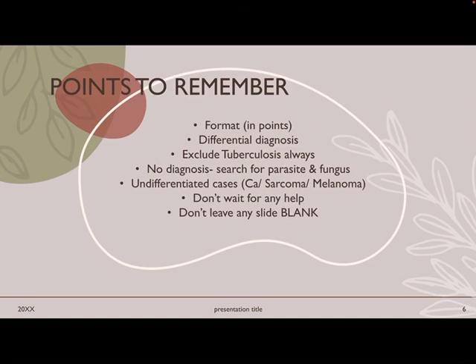Okay, at times during the exam you forget out of fear, but while practicing itself, try to see whether it's a case of TB. Okay, and then if you are not getting a diagnosis, start searching for parasites and fungus. Keep this in mind, okay? Because they are especially important slides during the exam. They will put parasite or fungus, obviously. So if you're not getting to a diagnosis in any histopathology or cytology slide, start searching for parasites and fungi, okay?